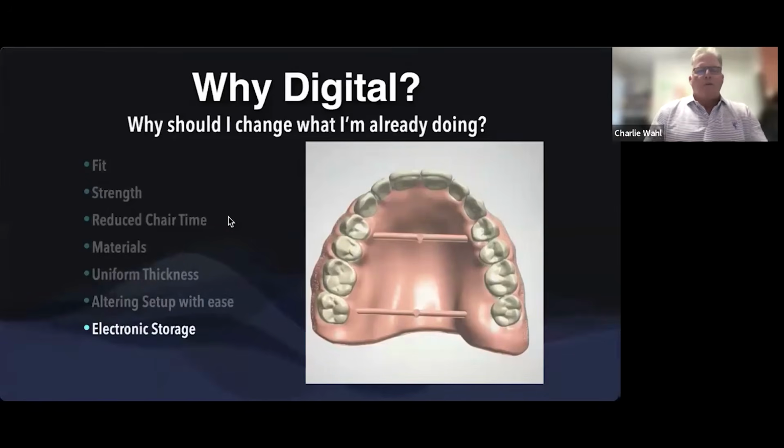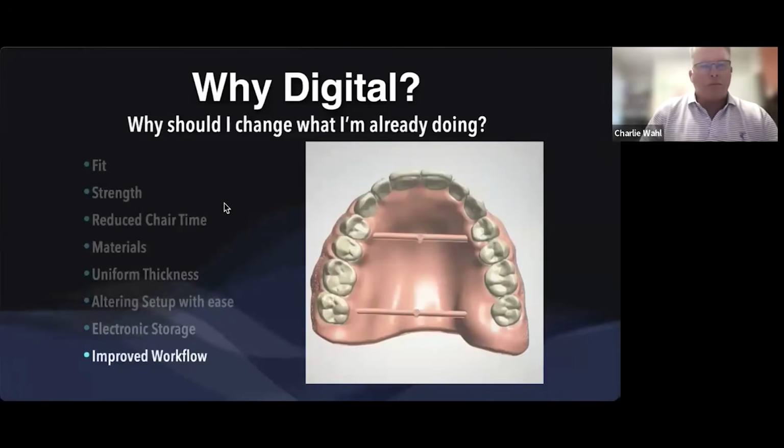The ability to have these files stored matters as our patients get older and transition into extended care facilities. You hear lots of stories of dentures getting lost or misplaced. The ability to refabricate with the push of a button is very important for our older patients.